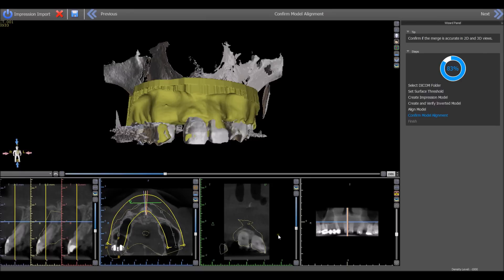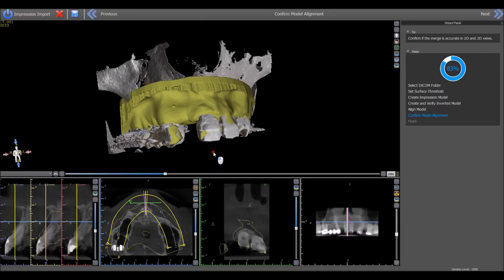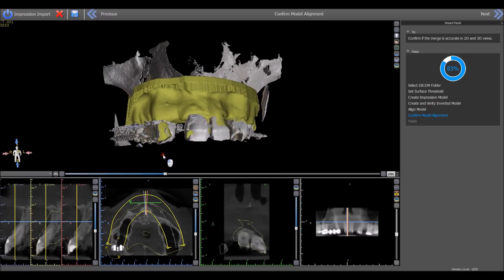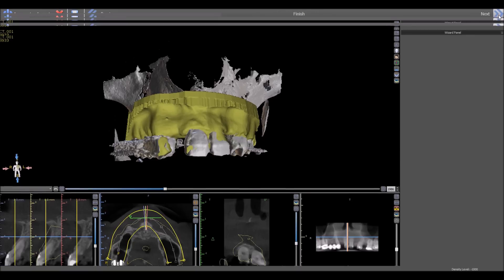In the last step of the importation process, we can confirm alignments in the 2D and 3D views. If we want to make any modifications, press the back button. Otherwise, press next to finish the importation process.